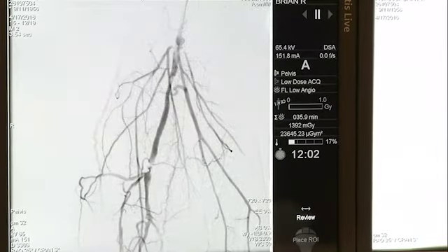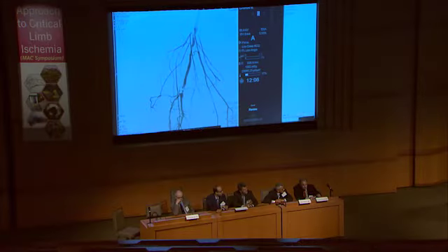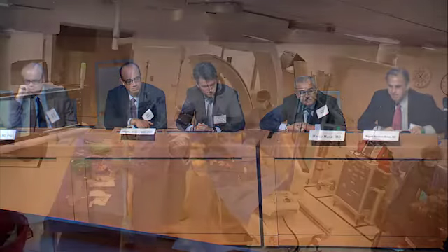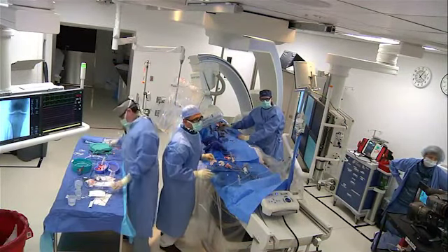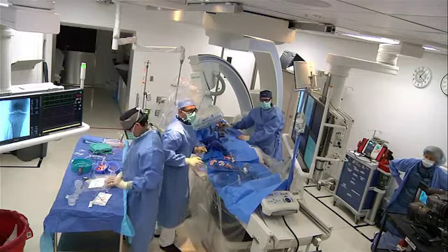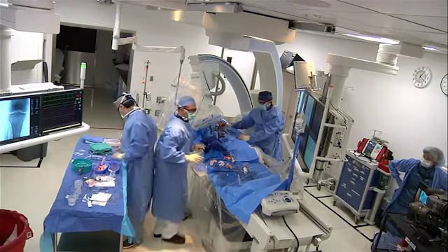It is. The other option would be to put a small wire now that you're across, because you've pushed the Nav across, which is a reasonable profile, and any of the .018 balloons should cross in the path that you've just made. V18, quick. Let's try the V18. Let's see if we can get into the peroneal, and then we use .018 balloons. Can you look for me for the .018 5 by 120 balloon and 150? .018 5 and 6 by 120 and 150.